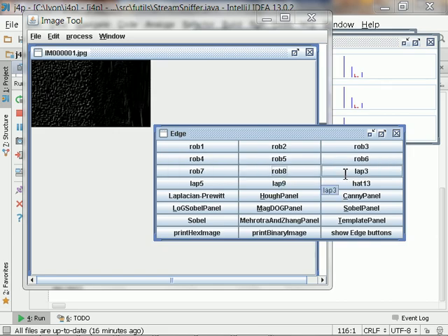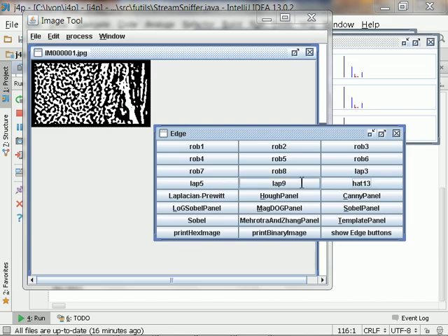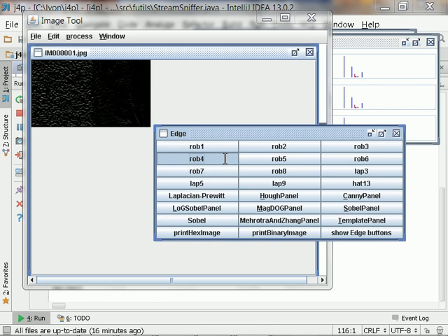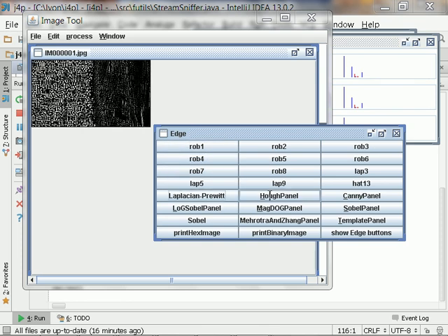because they're doing what's known as the Radon transform in order to get a 3D image. But you can see the edges that are being used here, they're not doing anything to reduce noise. In fact, what they're really doing is emphasizing the noise.